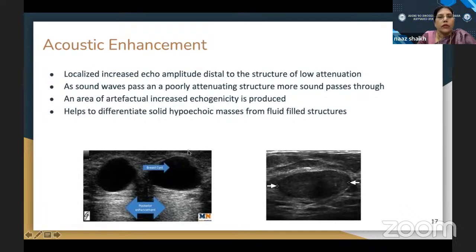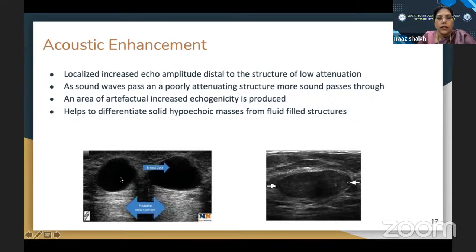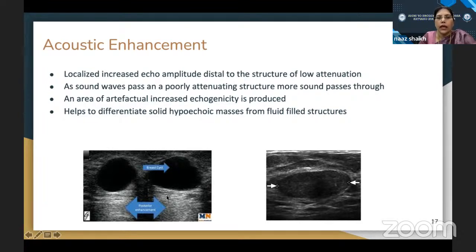Acoustic shadowing is another important feature — complete shadowing appears behind calculi, dirty shadowing occurs with ring-down artifacts from gas bubbles, and edge shadowing appears near the edges of the gallbladder. Recognizing these shadows helps make accurate diagnoses. Acoustic enhancement occurs when the sound beam passes through fluid completely, allowing more sound waves to pass behind, creating brightness — called post-acoustic enhancement. This is seen in cystic swellings and fibroadenomas.